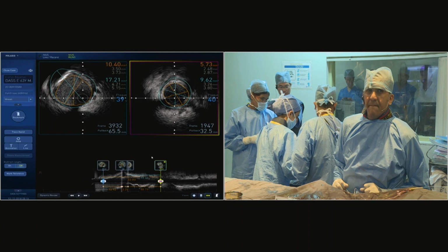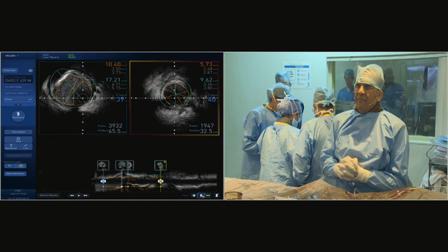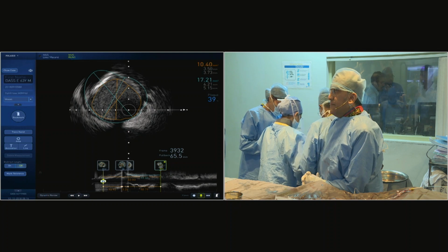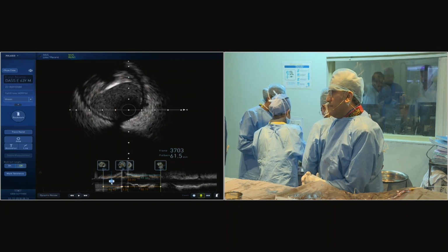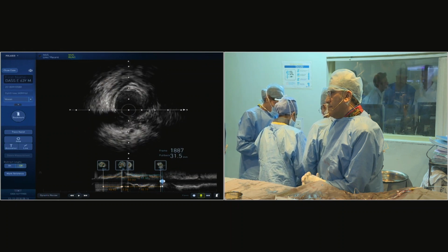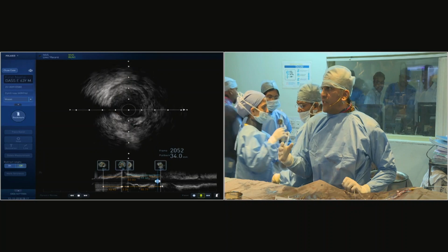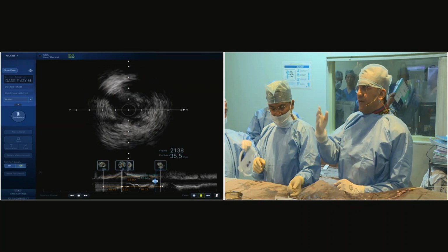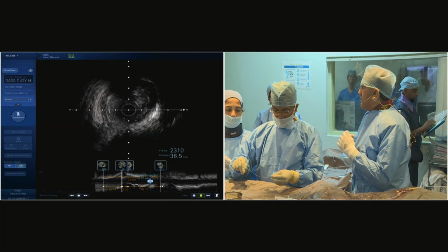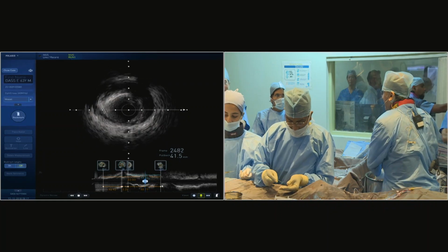Okay. Again, you have the left main. You had visualized the MLA; how much was it for the left main? Can you see that? MLA is 3.58, which is definitely significant for left main. But looking at the circumflex ostium, one can possibly say that one may get away without putting a wire there. My problem is that circumflex ostium visualization on IVUS by putting a catheter when there is a right angle bend is not easy, because the catheter never crosses the ostium in a transection. It's always an oblique view, always biased. So you are not going to get the best MLA.